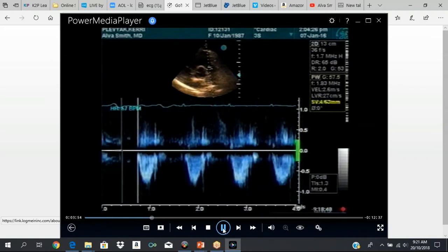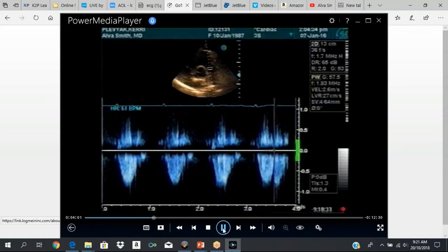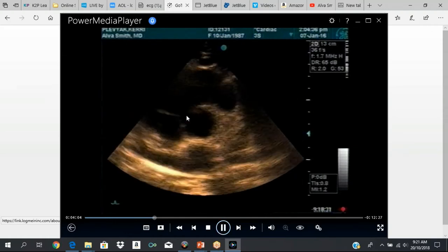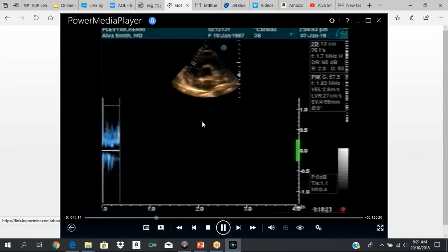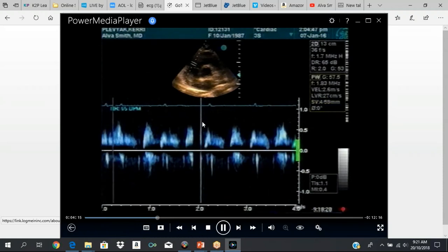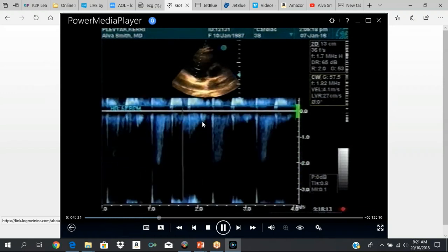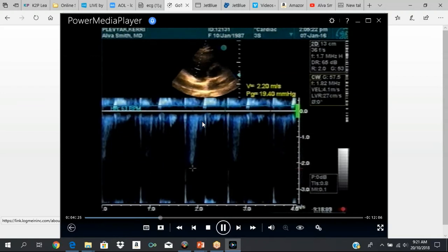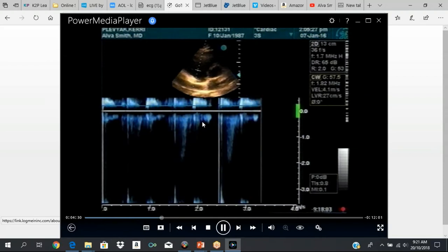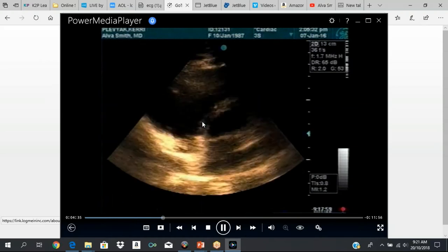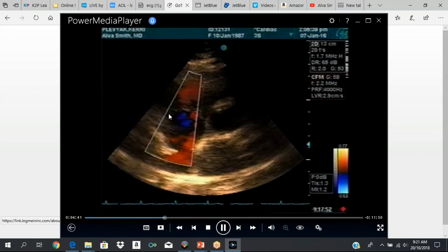Short axis at the level of the aorta: to the right, you have the pulmonic valve; to the left, the tricuspid valve. You can see the septal leaflet and the anterior leaflet. You can see the three cusps of the aortic valve. When the aortic valve opens, it opens in a triangular fashion. When it closes, you see the Mercedes-Benz sign — because you have three cusps, three leaflets. The tricuspid valve has the septal leaflet and the anterior leaflet.